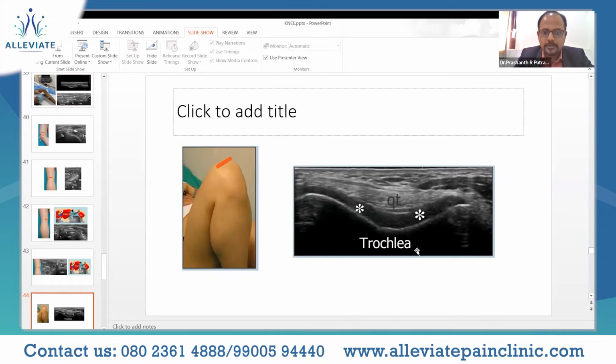So just above that you place it, and you will be able to see this particular structure, whereas this is the hyperechoic femoral condyle, intercondylar area, along with your trochlear cartilage. When you translate it medially, you come on to the medial aspect of the superior aspect of the medial condyle, which is the articular weight-bearing portion.